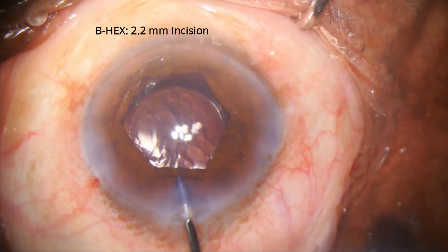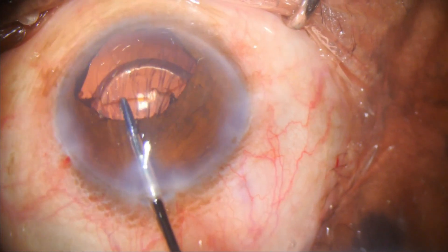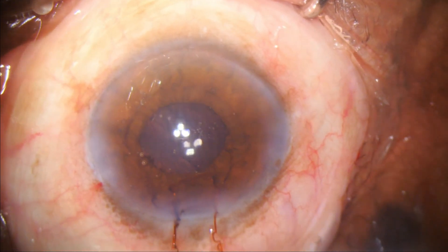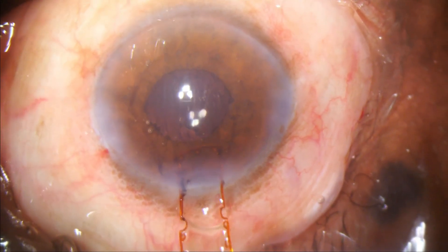A flange is held and advanced centrally. As the notches are disengaged, the B-hex is simply drawn out and the trailing notches disengage spontaneously.